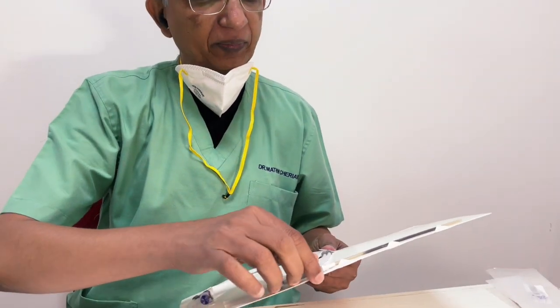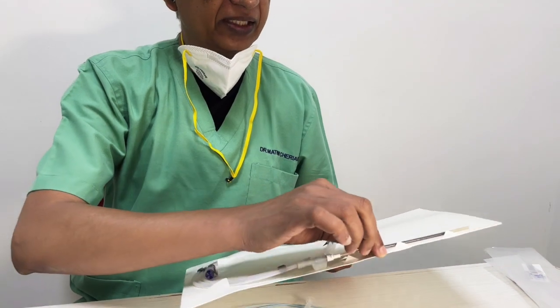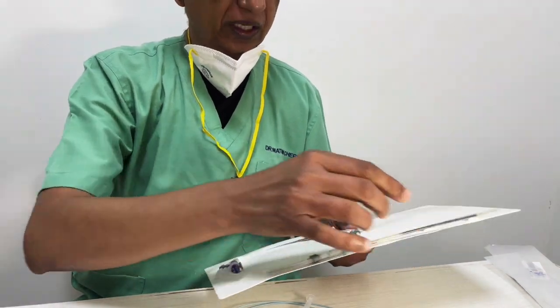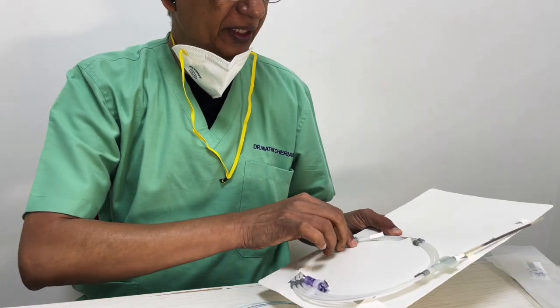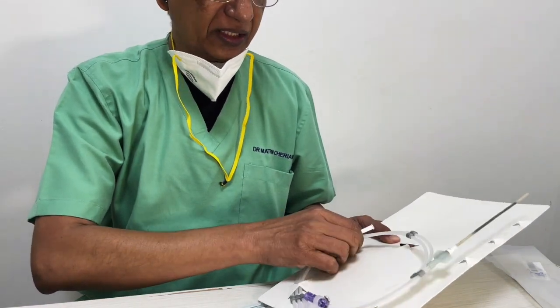Or for example, it's a very good device when you want to do a pulmonary artery AV fistula when you use a small vessel. So we actually love the device. The only problem we face is the supply chain in India of Amplatzer plugs is extremely poor. You often find the supply chain is not good, and often you do not have it ready made in the lab. But as a device, remember, it's probably one of the best devices that you can use.